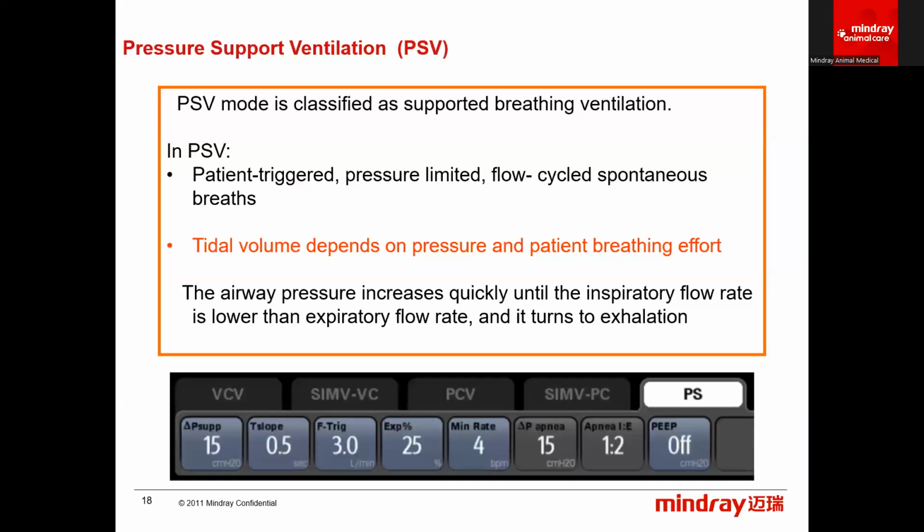your ventilator. Now, pressure support ventilation is what we call an intelligent ventilation mode. It is a supported breathing mode. So with our supported modes, if we consider back to our three little groups, PSV is actually the synchronized level.